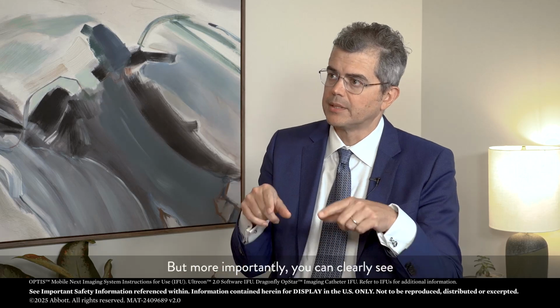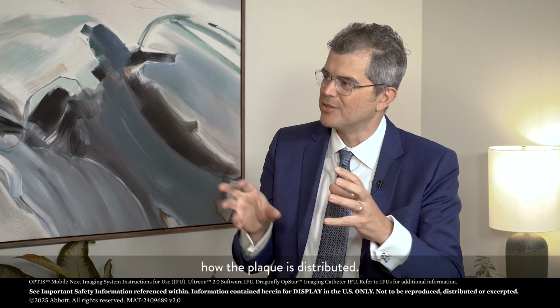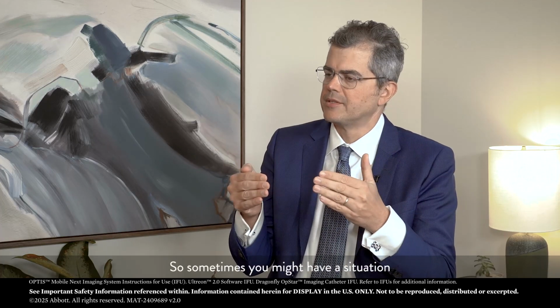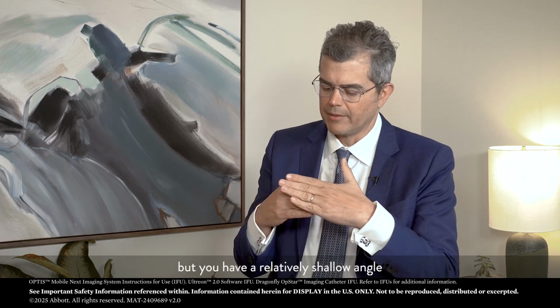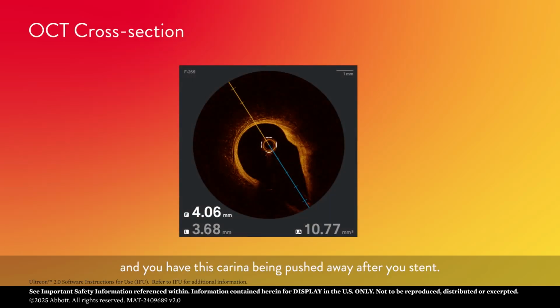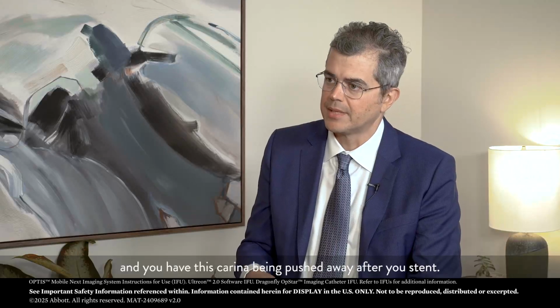But more importantly, you can clearly see how the plaque is distributed. Sometimes you might have a situation in which you have virtually no plaque at the ostium of the side branch, but you have a relatively shallow angle, and you have this carina being pushed away after you stent.